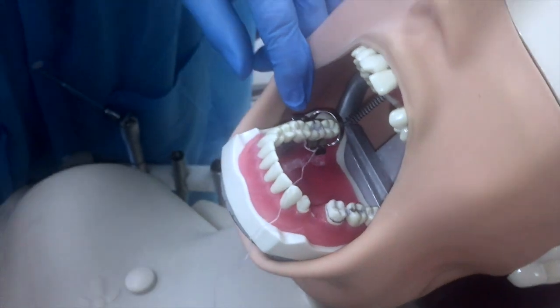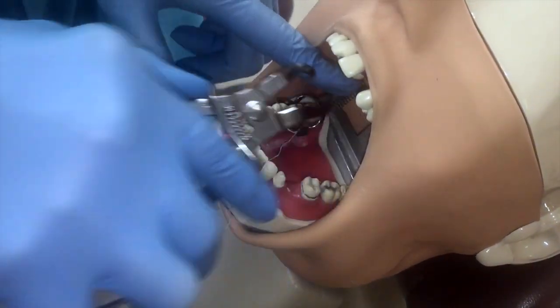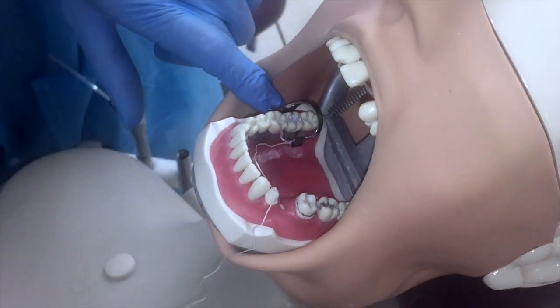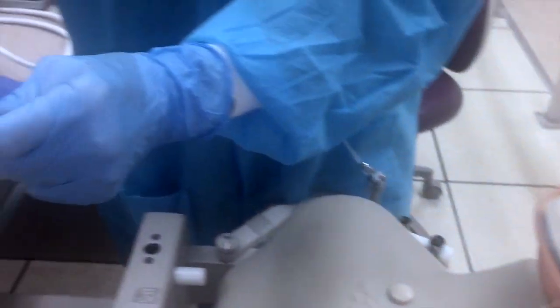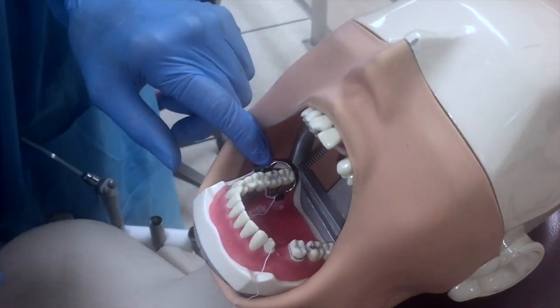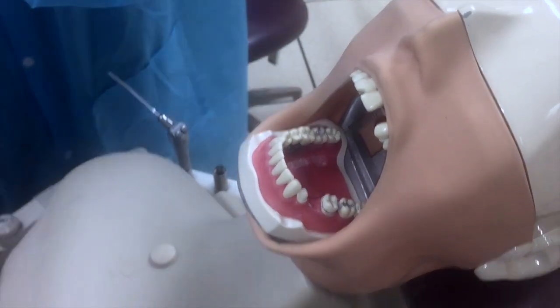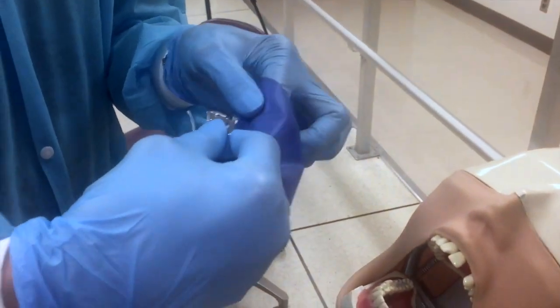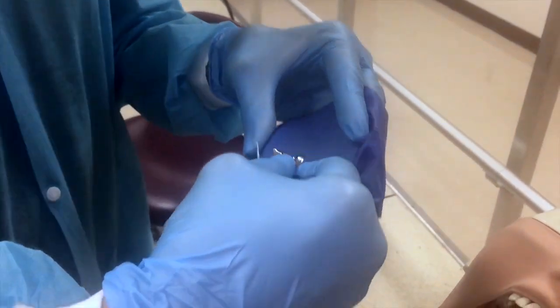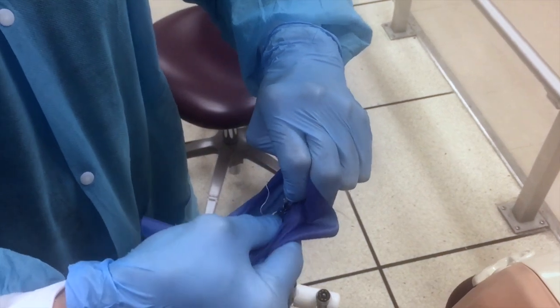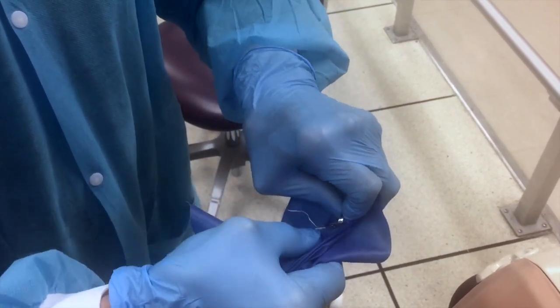Now we're happy. There are two ways you can do this. You could actually stretch the rubber dam, stretch one of those holes all the way over the dam. But these rubber dams that we have in lab, some of them are pretty thin. The problem with that is sometimes you can tear the dam. But I like it because you can see so well. Here's another way of doing it. You can actually stretch the hole over the wings like so.